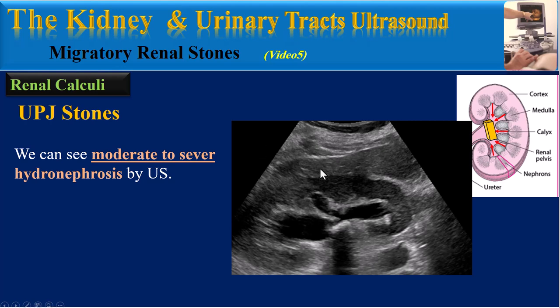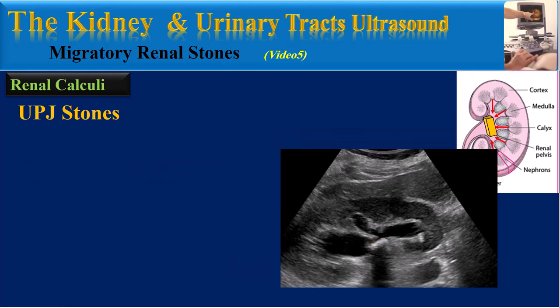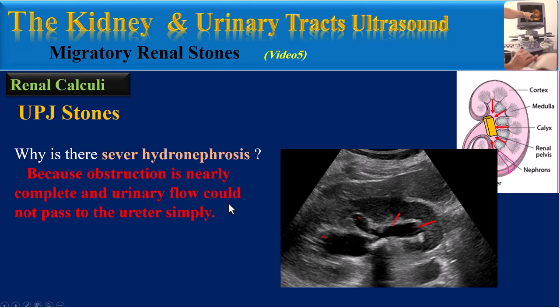When the patient presents for ultrasound, we can find moderate to severe hydronephrosis, as you can see in this trans-abdominal ultrasound image. We can see a large UPJ stone. There is severe hydronephrosis because the obstruction is nearly complete and urinary flow could not pass to the ureter.